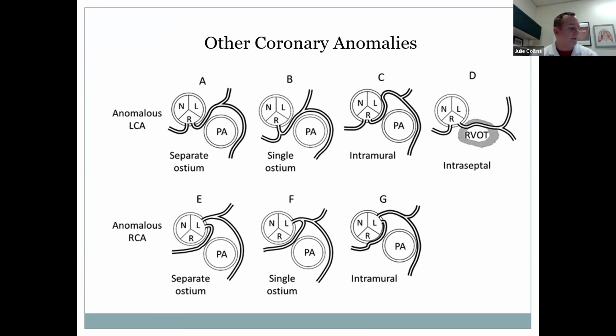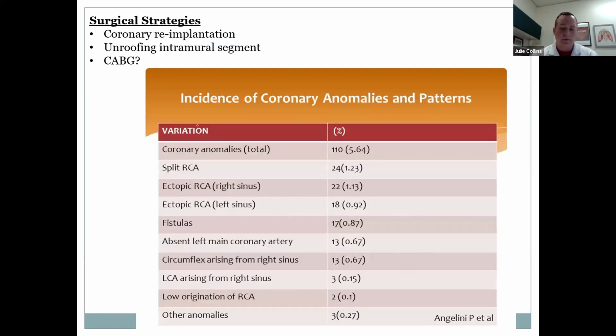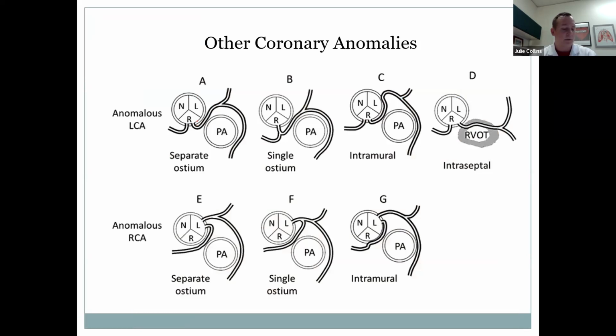So in an unroofing, basically there's a shared, this slide doesn't really show it so well. But there's a shared intramural surface here, typically.